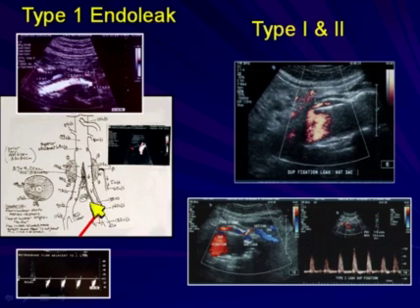There was not a good seal due to calcific plaque at the distal common iliac. And here you can see flow going towards the foot, depicted here in sort of a pink-red color, and then back up towards the aneurysm sac, adjacent in this iliac artery in blue. You can see retrograde flow. Because this was originating from the graft itself, it had the same waveform characteristics of the graft and was biphasic.